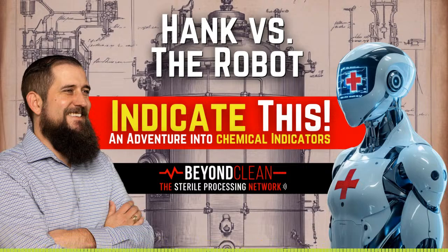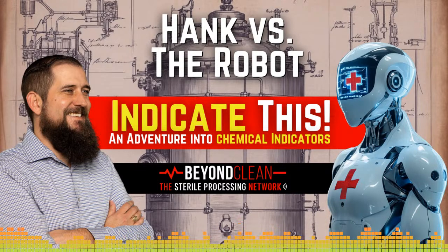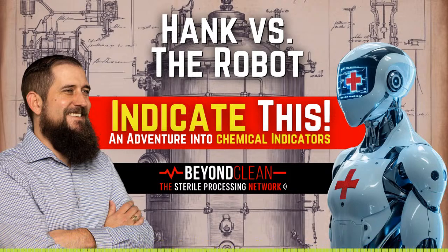Should we move away from color? Not necessarily move away, but we should evolve. Color-based indicators have their place, especially for low-cost, quick checks. But for high-stakes scenarios like implants, more precise tools like moving ink lines or even digital monitors provide greater assurance. It's like transitioning from a check engine light to a car diagnostic tool. The light tells you something's up, but the diagnostic tool gives you the specifics. In SPD, we need both, the quick visual cue for routine tasks and the detailed assurance for critical loads. It's about matching the tool to the task and staying open to innovation.